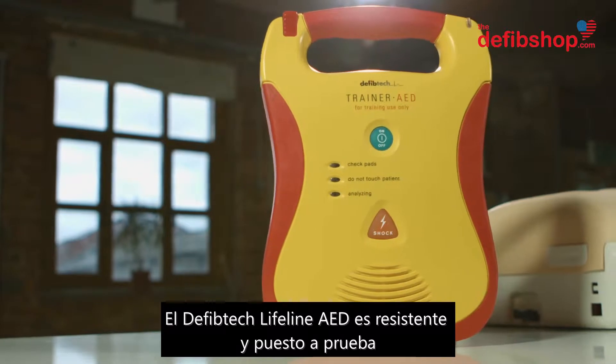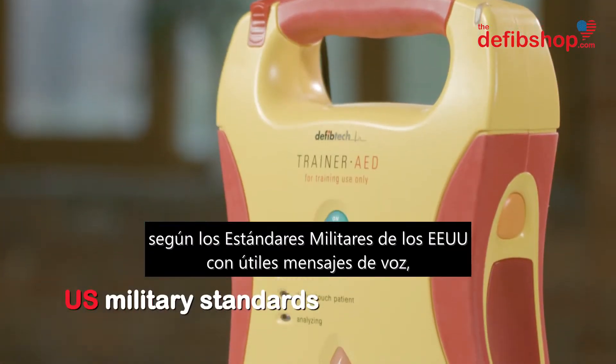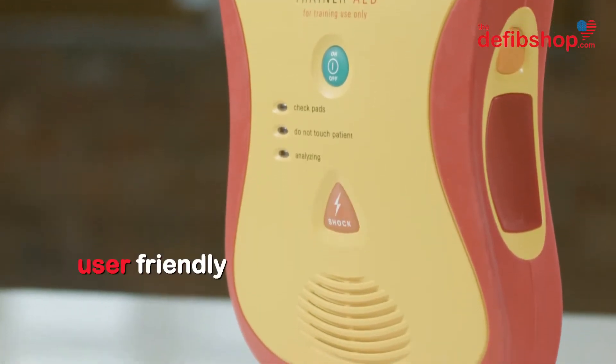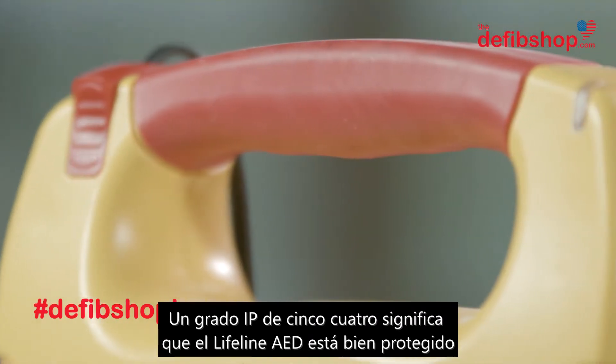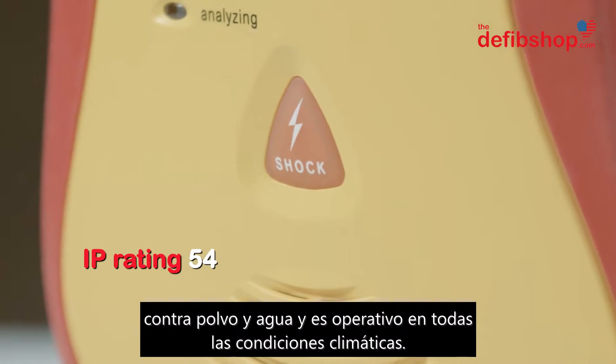The DefibTech Lifeline AED is robust and tested to U.S. military standards, with helpful voice prompts making it a popular choice for a range of environments. An IP rating of 5-4 means the Lifeline AED is well protected against dust and water and is functional in all weather conditions.